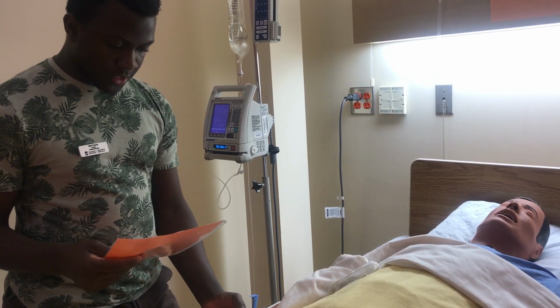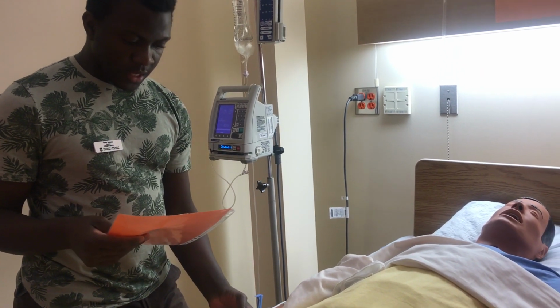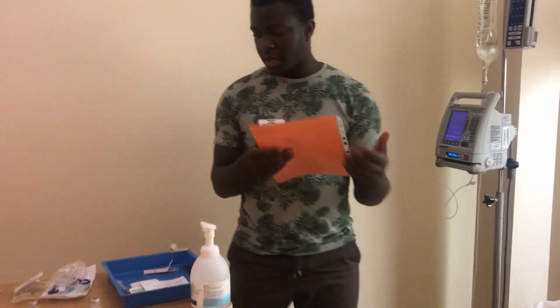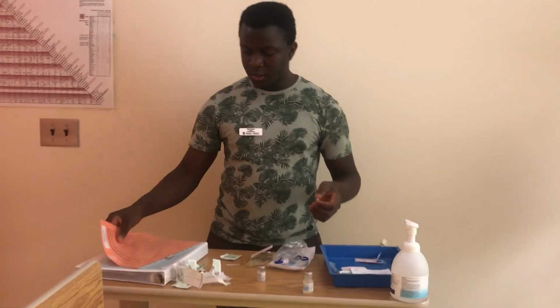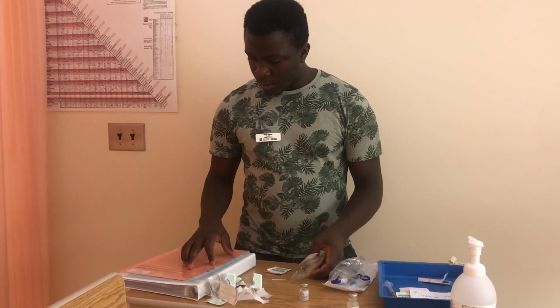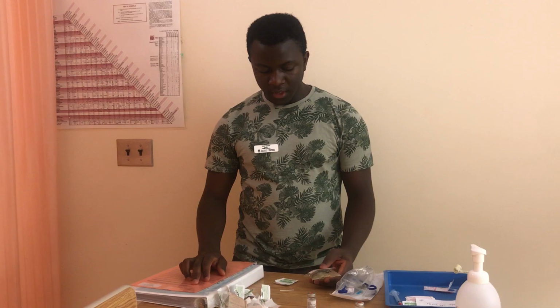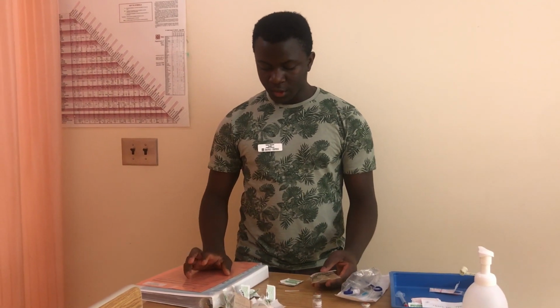30 years, thank you. And do you have any allergies at all? You're allergic to morphine, okay. Thank you. Okay, so this is my right patient. I'll just do my third check as well to make sure that everything is fine before I go ahead and put it on the pump. So Emma Whitson, I just checked that's my right patient. They are allergic to morphine. This medication is not morphine, so we're good to go.